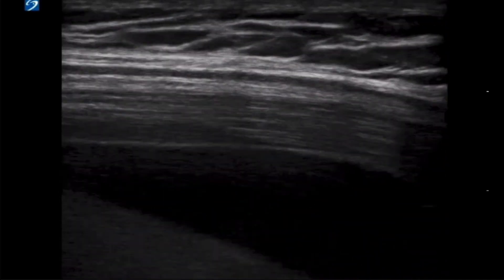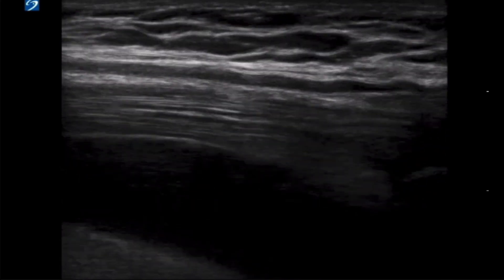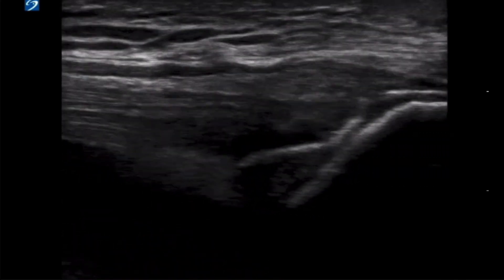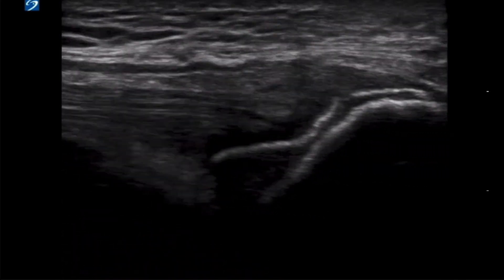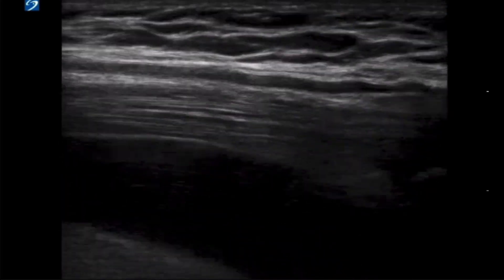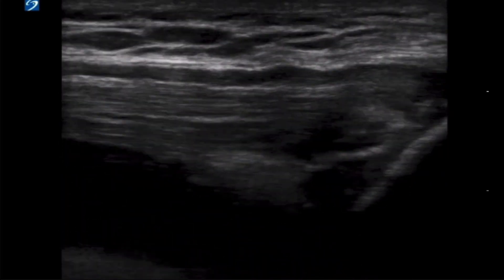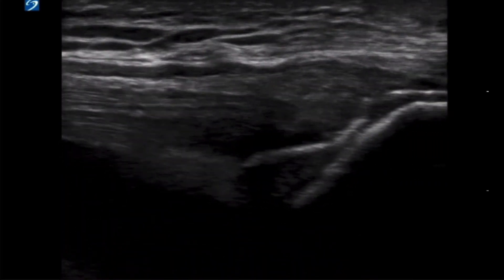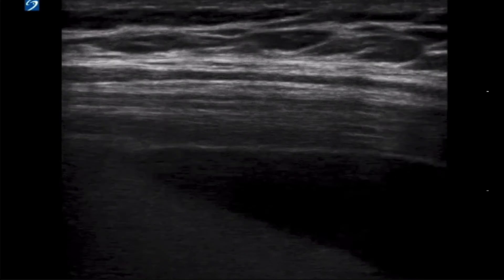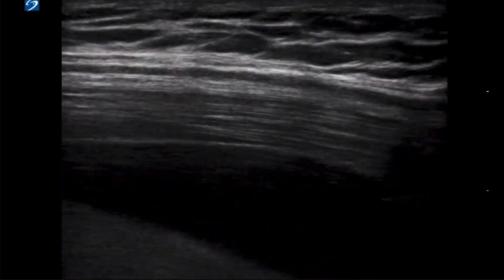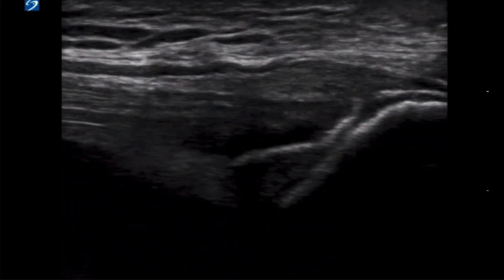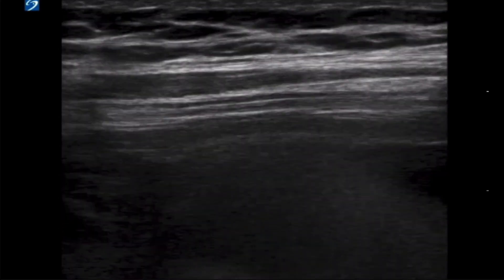Now that we have covered basic anatomy, take another look at an ultrasound video to appreciate all the structures we just covered. This video starts more proximal on the thigh and slides distally as the video progresses. Once again, we are in a long axis orientation. The effusion deep to the quadriceps tendon is once again visualized.